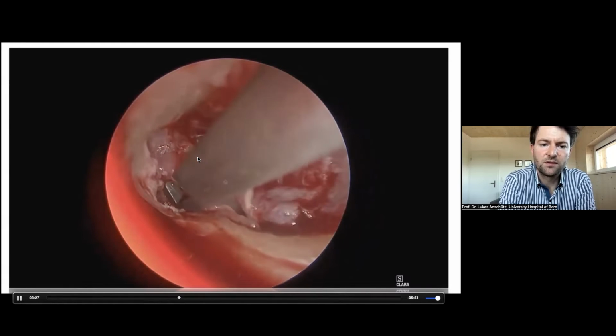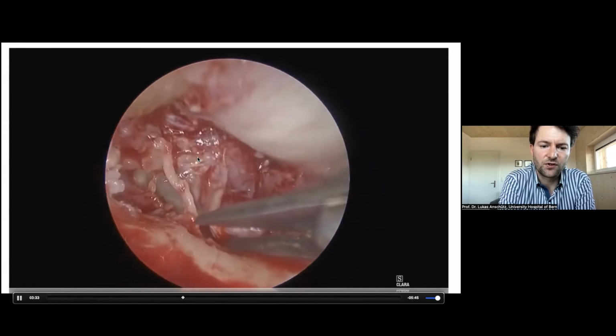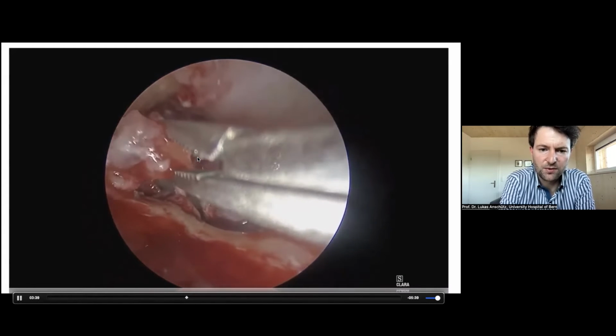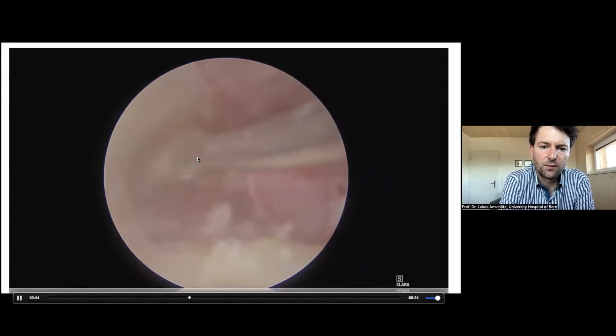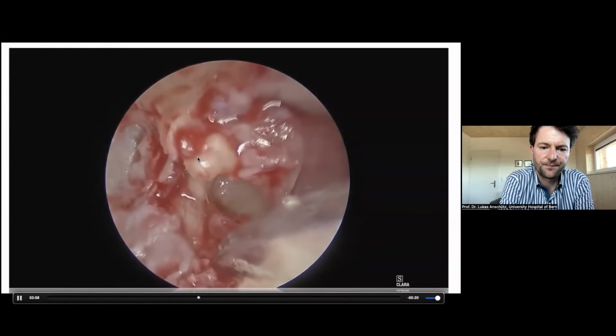And here the chorda tympani was really inside the cholesteatoma, so for security or safety reasons, I cut it away. The head of the hammer comes out here. And now the approach is enlarged until we can completely dissect and identify the sac of the cholesteatoma. So this is now the situation.